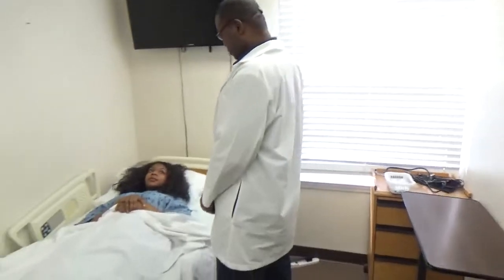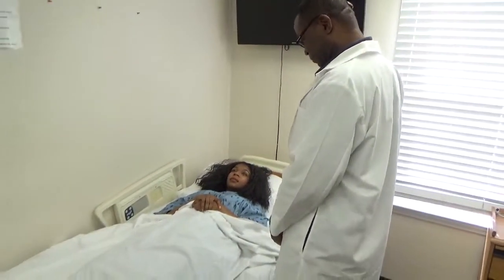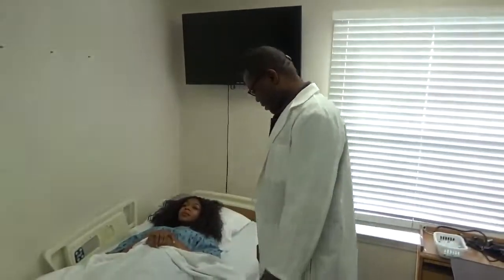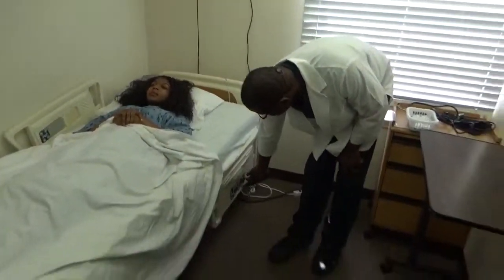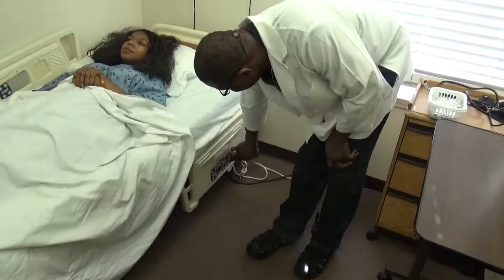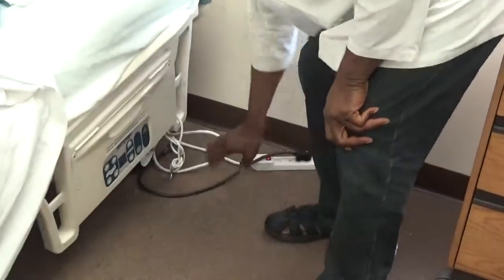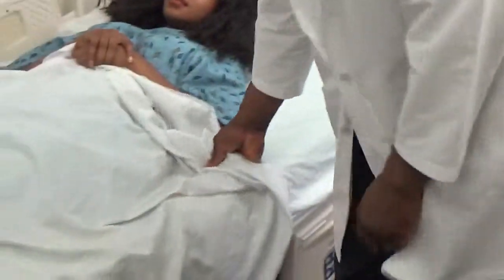Ms. Janice, next I'm going to assist you to measure your blood pressure. Provide privacy. Make sure the bed is in a safe position. Bed is locked.